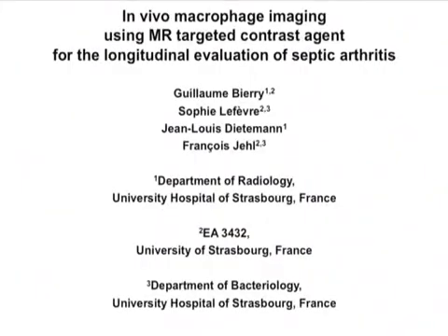The overall goal of this experiment is to longitudinally evaluate the macrophage infiltration within the synovium in a rabbit model of septic arthritis using MR imaging. This could be performed with the use of iron oxide particles that label macrophages and reveal their presence.